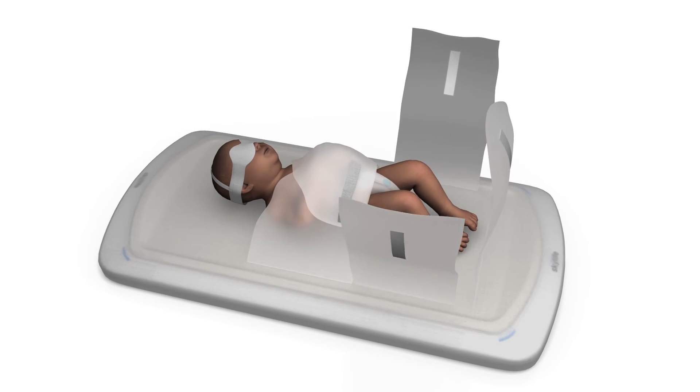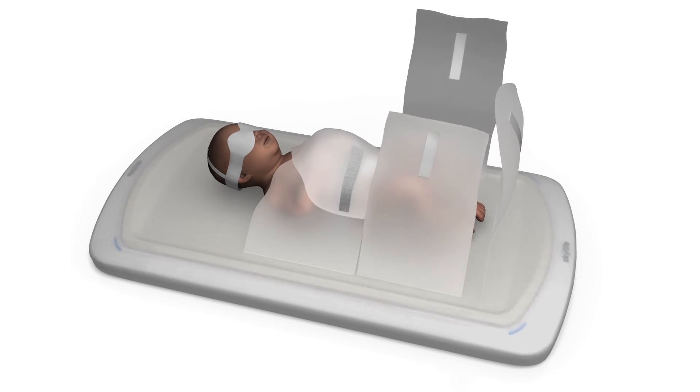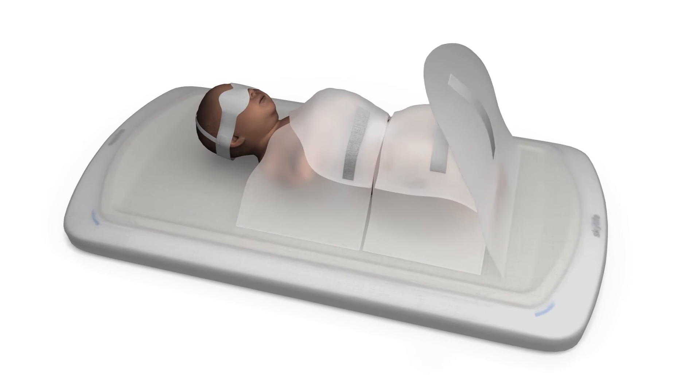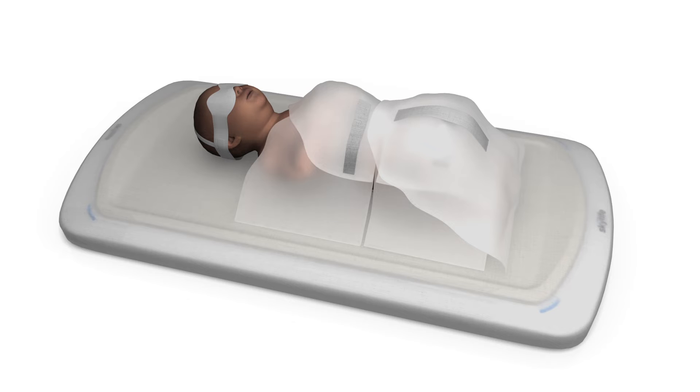Repeat this process with the lower flaps. When the flaps are secured, position the bottom flap over the side flaps. Press firmly so the Velcro is secure.